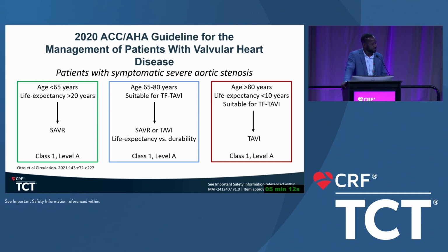And with some of the other self-expanding valves, it is a bigger deal because you have this stent frame in the middle. There have been cases that we're unable to do BASILICA on because the post is right under the right coronary artery. As much as Keith and I and other surgeons try to organize it, sometimes it doesn't align, especially with the right coronary artery, because in some instances it is very close to the non-right commissure. And no matter what you do, if you rotate it too much into the non-coronary cusp, then you're going to get the post in front of the left main. So this becomes very difficult. We do also see that with surgical issues, but I agree with Azeem and Bassem.